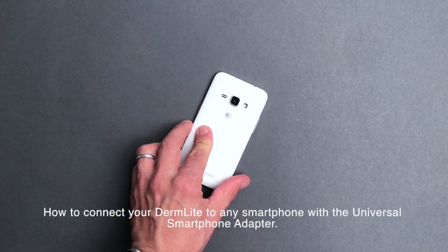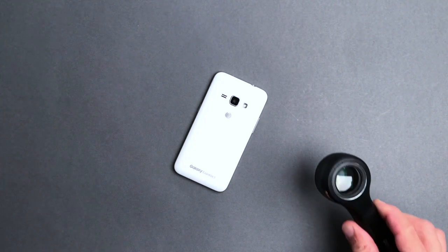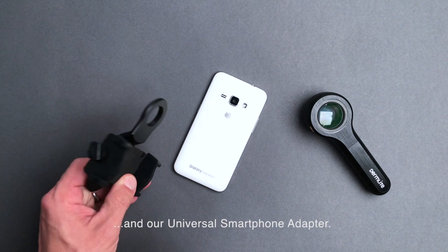How to connect your DermLight to any smartphone with the Universal Smartphone Adapter. Here's what you need: a smartphone, a DermLight, and our Universal Smartphone Adapter.